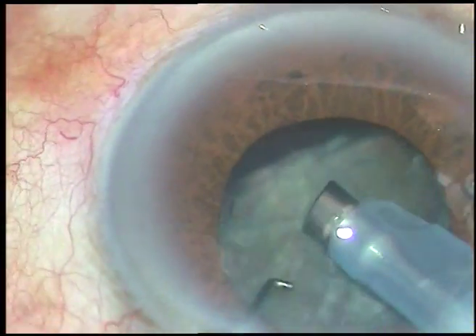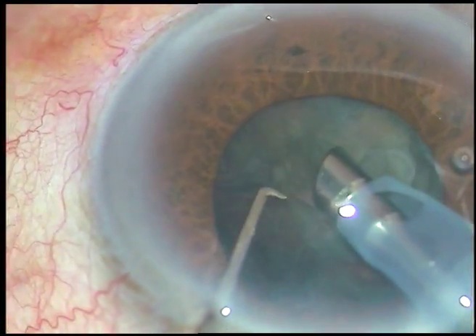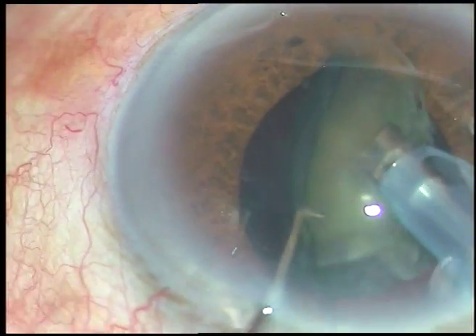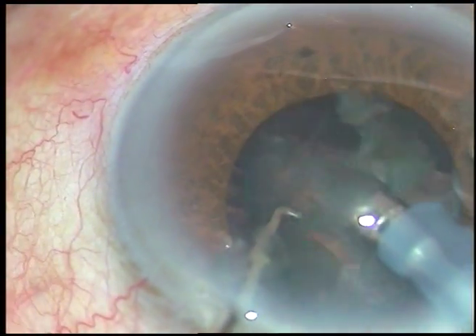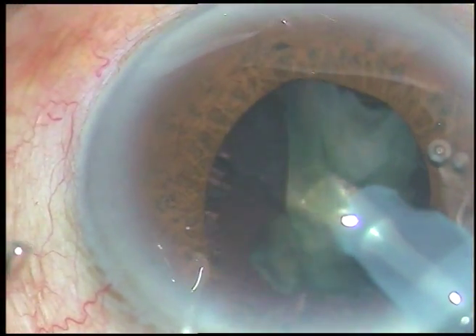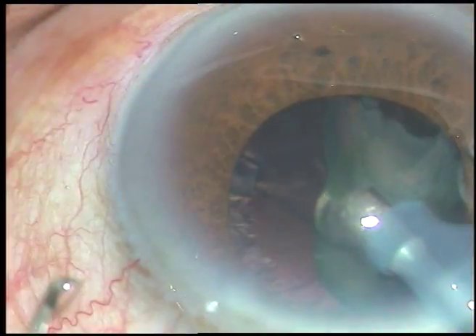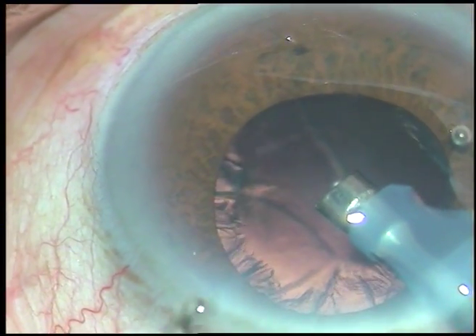Half of the nucleus has been managed. This is the other half. I just held the nuclear mass, tilted it, and am removing it. That's it — the nucleus is managed.